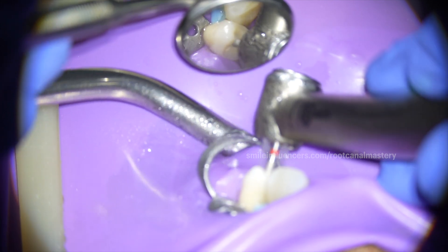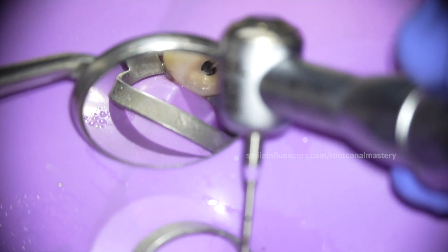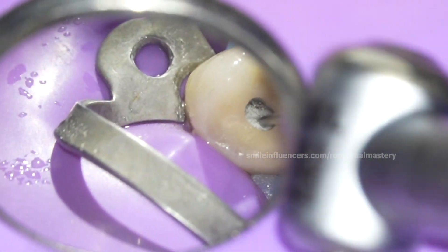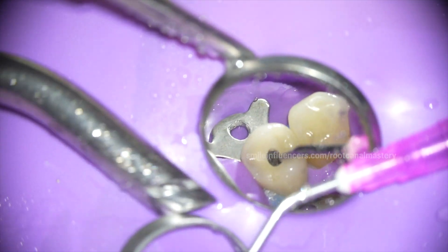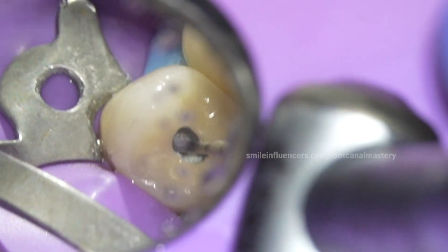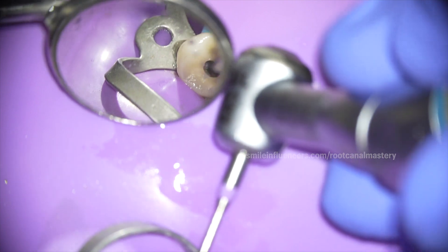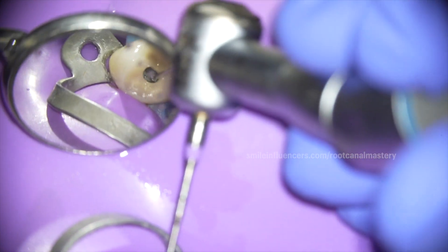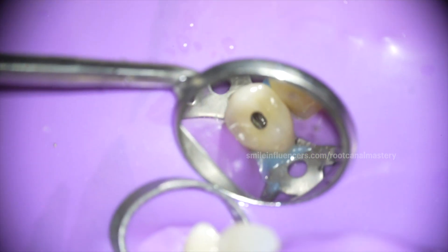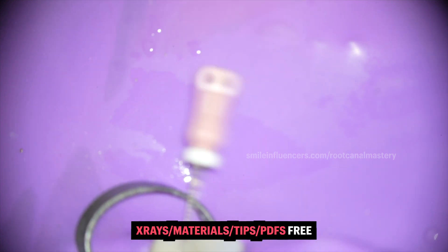Let's get started. This is very calcified — but remember when I told you about this?